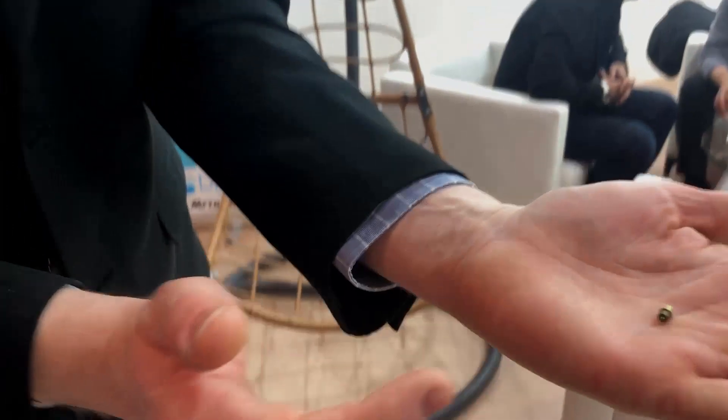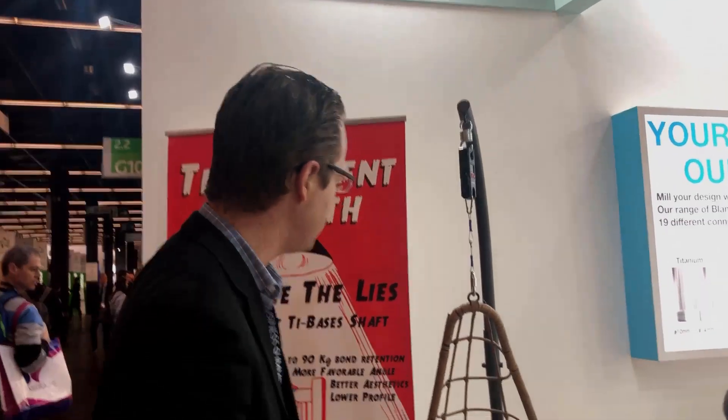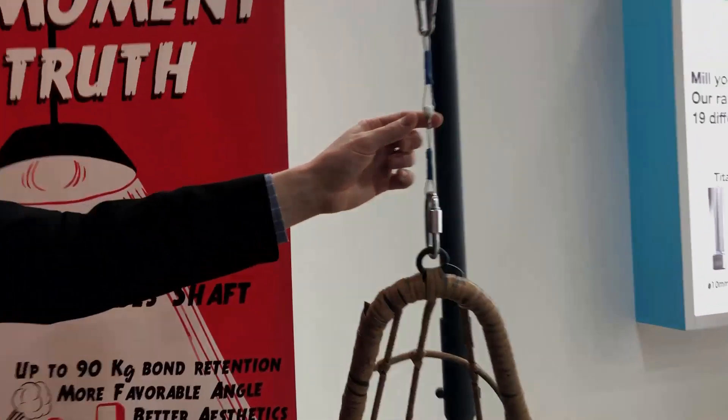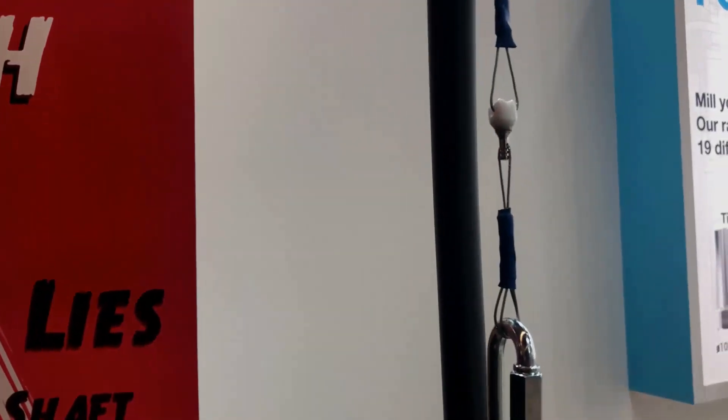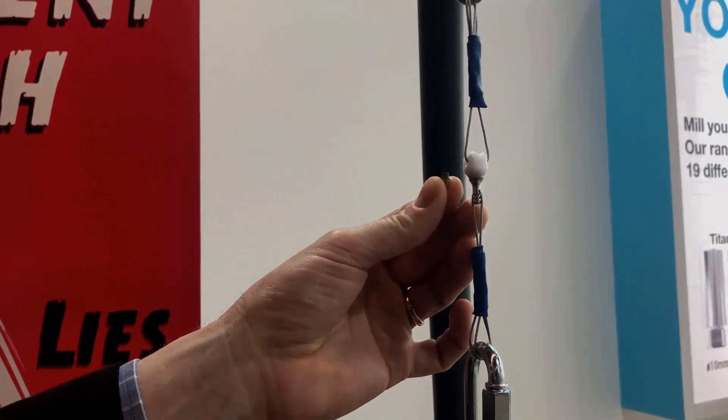Especially with angled tie bases — are those going to be efficient and effective enough to use in larger cases? One cool thing that Des here at the IDS has done is they've taken their Arum tie base, which is an angled tie base with a very small three millimeter tall bonded tie base, and with resin cement they bonded a zirconia crown to a metal analog with the Arum tie base.